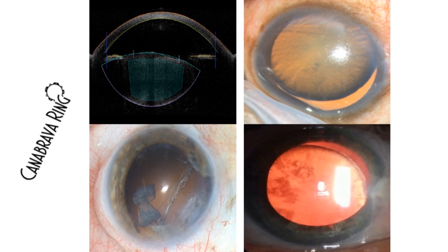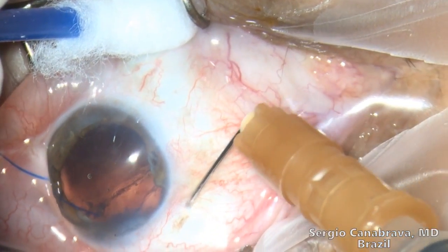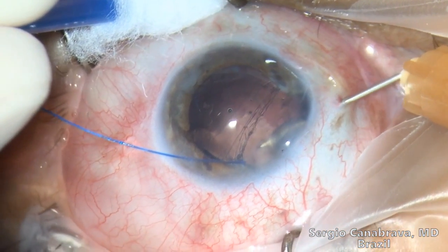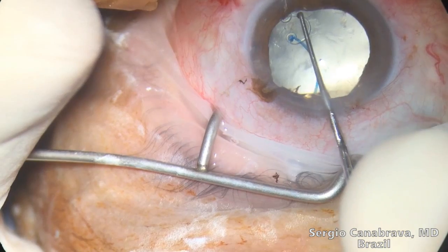Today I will present this technique with four challenge cases. Let's go to the action. Step 1: A sclerectomy about 2 mm from the limbus in the same quadrant of the zonular weakness is made using a 30-gauge needle. The needle does not penetrate the capsular bag while creating a space to the anterior chamber.